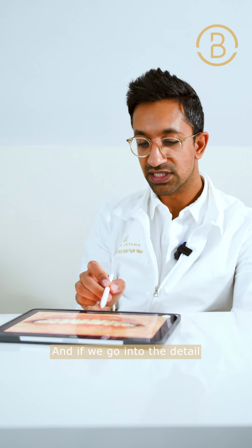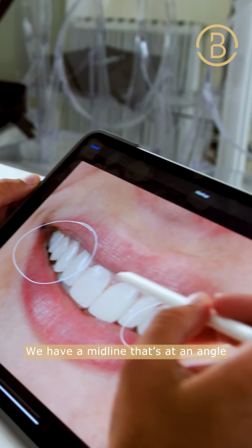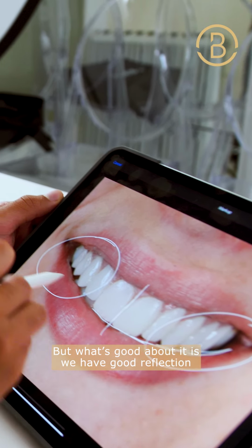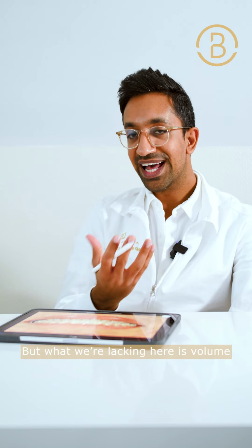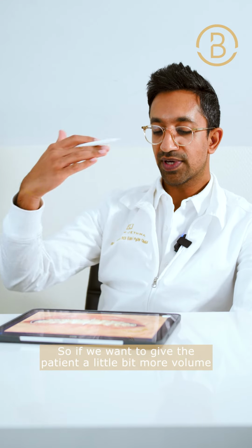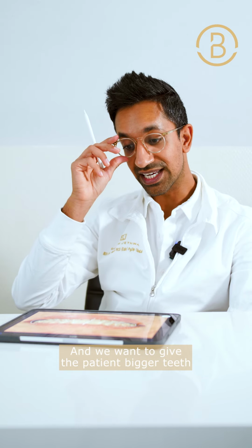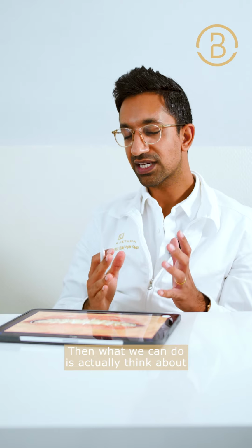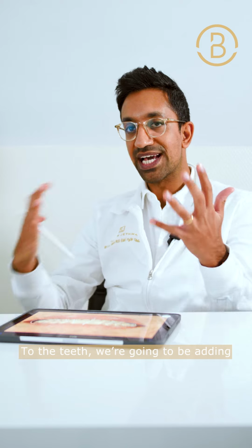And if we go into the detail, overall this side is a little bit narrower, this side is a little bit wider. We have a midline that's at an angle. But what's good about it is we have good reflection, we have good overall structure in the jaw, but what we're lacking here is volume, and we have small teeth. So if we want to give the patient a little bit more volume, and bigger teeth, not big teeth, but bigger teeth, then what we can do is actually think about producing this result minimally, because we're being additive in nature to the teeth. We're going to be adding.